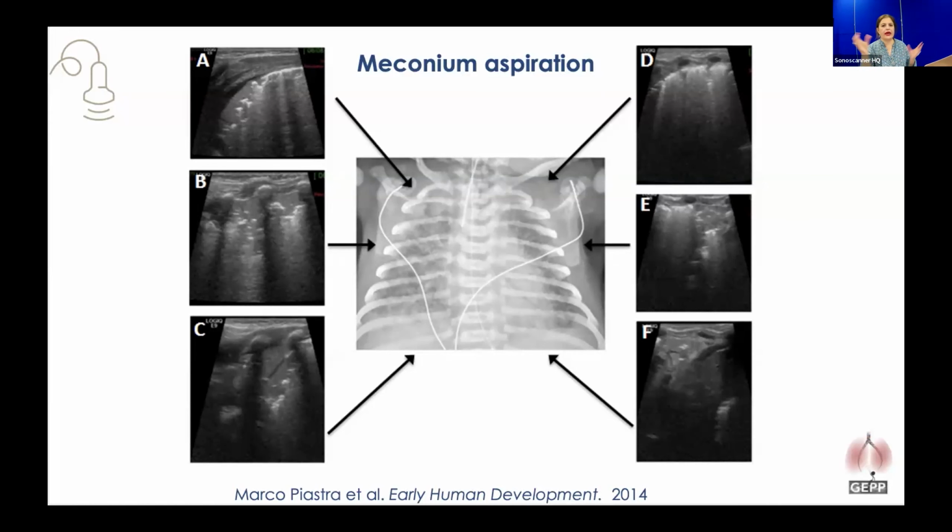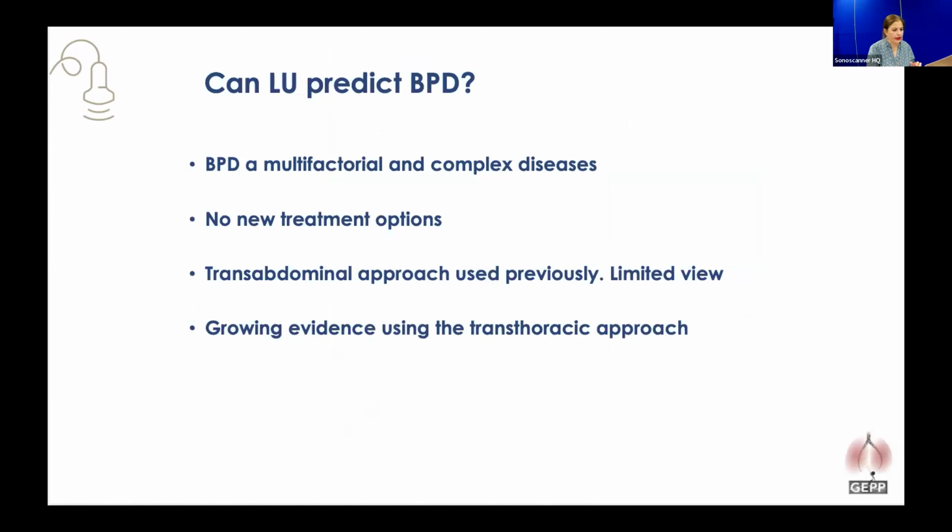The plugs, you know, what you're expecting is exactly what you see. Meconium plugs will plug the airways, which will collapse. And then you've got the surfactant inactivation and the inflammation coming in. And this mismatch, right, and this extremely heterogeneous lung. And you can follow that up on lung ultrasound, and you're able to see how your management will change, how when the meconium is dissolved, how that changes. So it's a very valuable tool, not only for the diagnosis, because that you usually have, but also and specifically for the management and ventilation guidance, and so on.